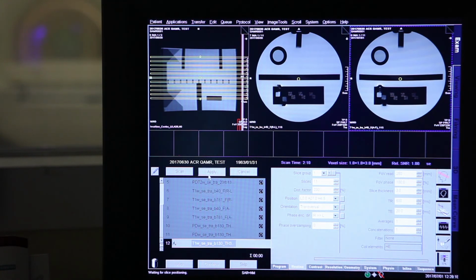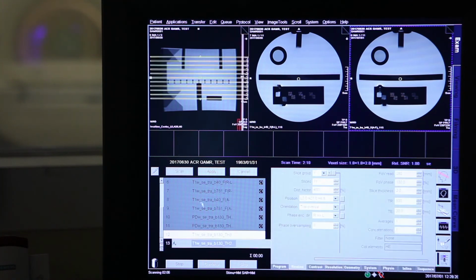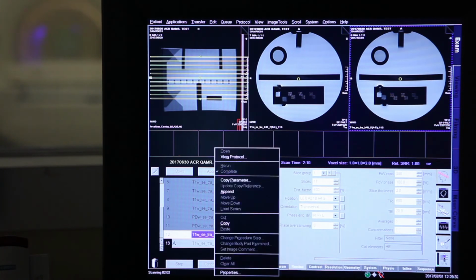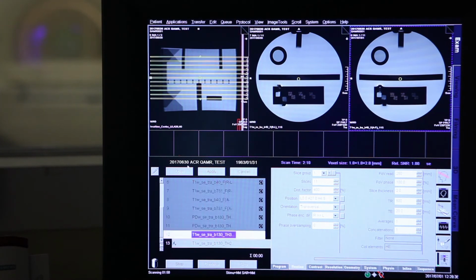You start with this, again 11 slices. And then I'll take another one, numbered 2 millimeter slice. And then we do the analysis for the SNR. Even further apart, exactly. The distance factor is 400 now. Again, we copy the parameters and shift to the middle.